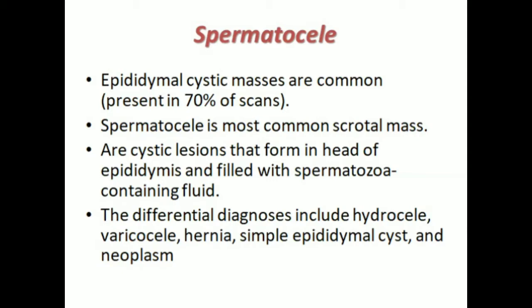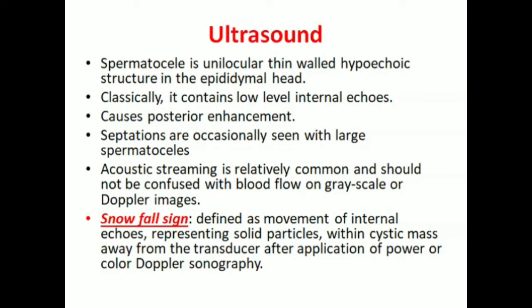The fluid-containing differential diagnosis includes hydrocele, varicocele, hernia, epididymal cyst, and neoplasms. On ultrasound, a spermatocele is a unilocular, thin-walled hypoechoic structure in the epididymal head. Classically it contains low-level internal echoes. Being a cystic lesion, it causes posterior enhancement. Septations are occasionally seen with large spermatoceles.